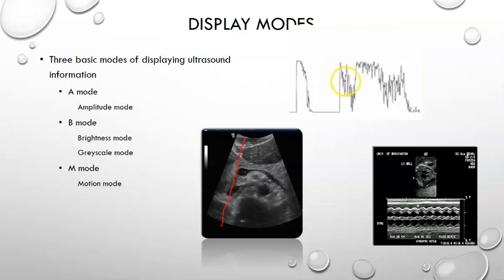And then past that are some echogenic material that is of varying brightness and it's attenuating. It's getting weaker as we go deeper, and then it's a dark structure at this point, and then moving upward, another bright wall here, and that just slowly fades off into darkness on our image at the far deepest portion of the image down here, where we're getting very weak echoes back. This is called amplitude mode. This is what each scan line is based on.